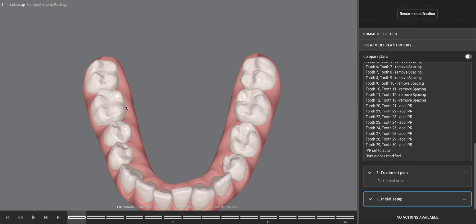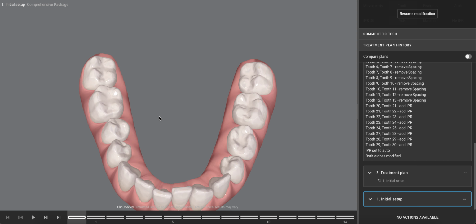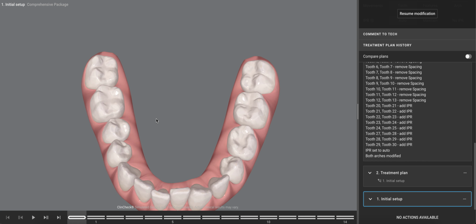But in a nutshell, when I see a patient who is at low biomechanical risk, meaning I don't see a lot of attrition here, I do see some wear facets, but that's probably more due to the fact that her occlusion is about ready to get an upgrade, and not so much central nervous system mediated bruxism, airway bruxism, things that are external factors that are likely to influence attrition of the teeth. Mutually protected occlusion in those patients might be a more ideal outcome.